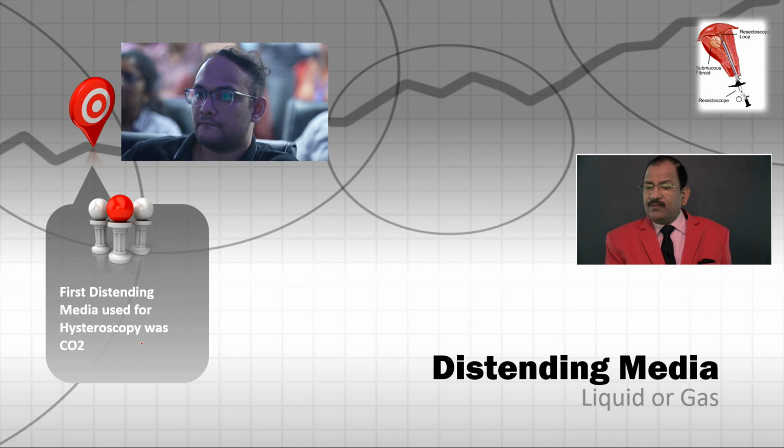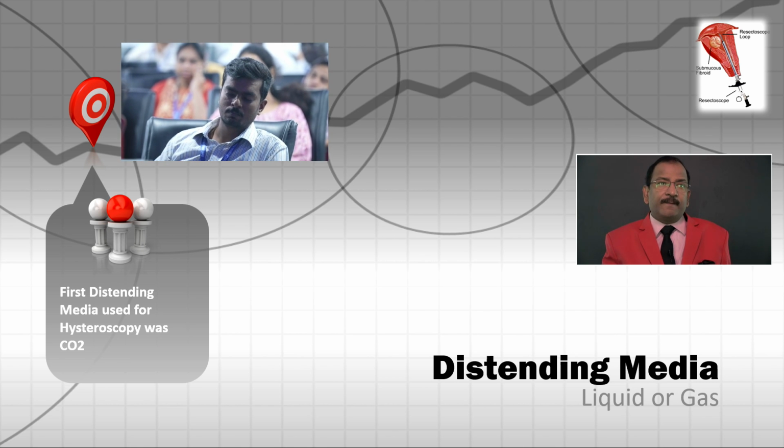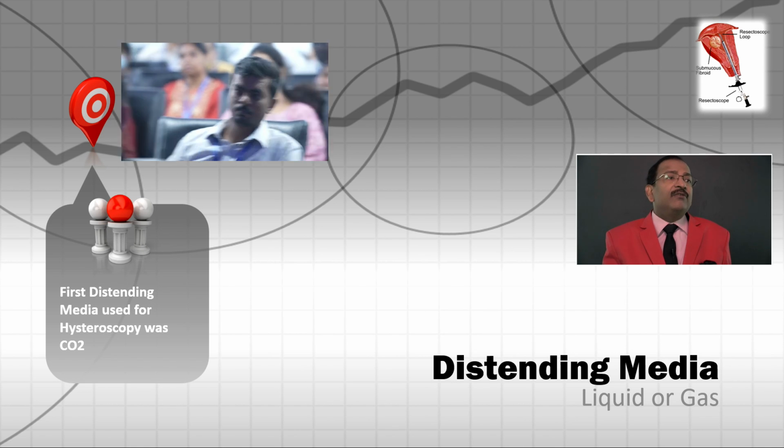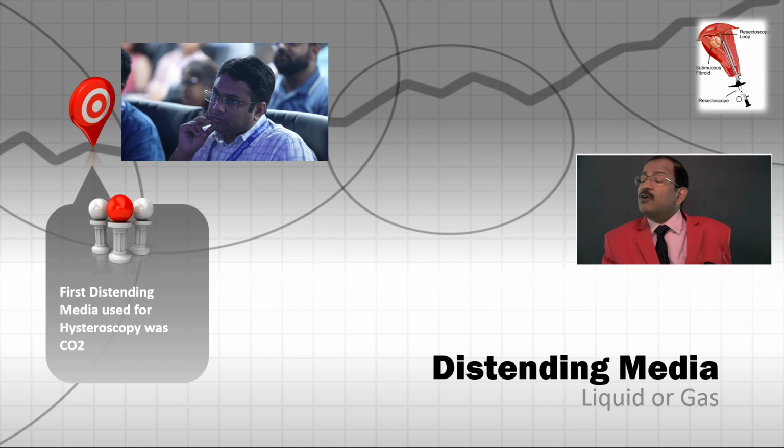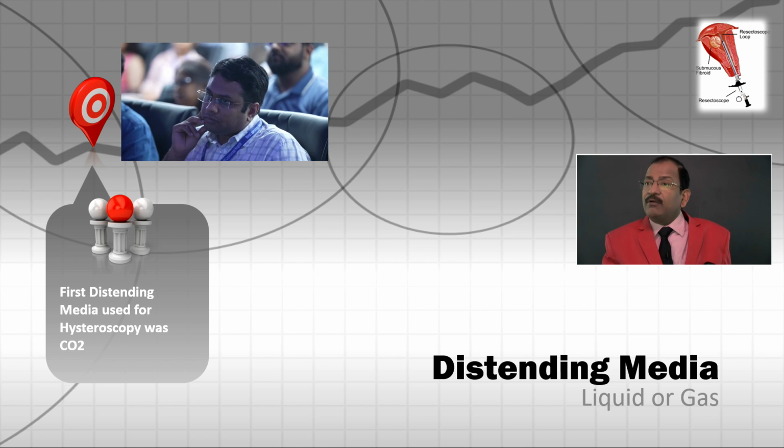Another problem of diagnostic hysteroscopy with CO2 is that you cannot do operative hysteroscopy, because if you use current, it will smoke out your lens. In the fluid environment, it won't smoke out, because smoke will not be produced in fluid. Why?